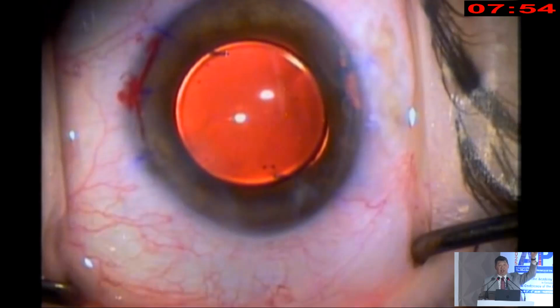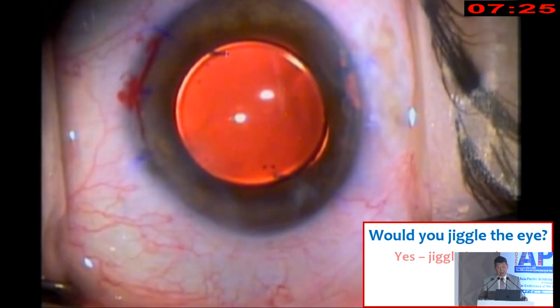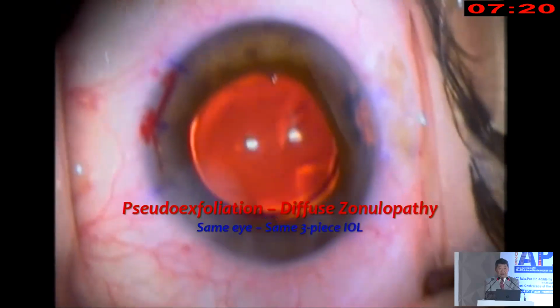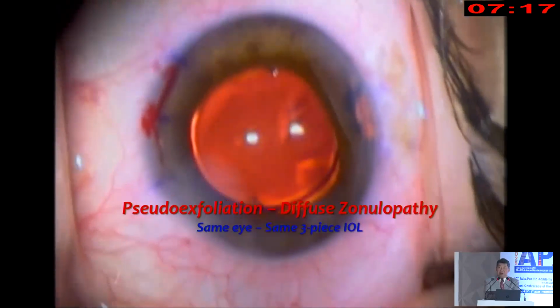So how many people want to test it and jiggle it? How many would jiggle the eye? Okay. How many people, thinking we've done enough, we don't want to know anymore, would not jiggle the eye? Raise your hand. How many people would not jiggle the eye? Okay, yeah, this is how we do it. How many of you wouldn't jiggle the eye, but want to see what happens if I jiggle the eye? That's what usually happens. So okay, here, I'm going to jiggle the eye once, and look what happens. Wow, this is great.